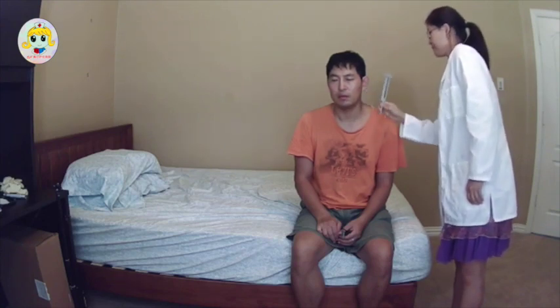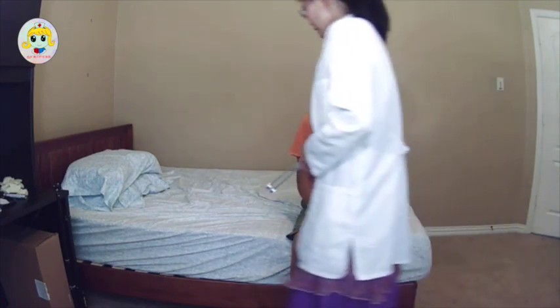Cannot hear it. Okay, for the Weber test, the patient could hear the sound equally in both ears. And for the Rinne test, the air conduction is longer than the bone conduction, which means the hearing is normal for the patient. This is the end of the ear test.